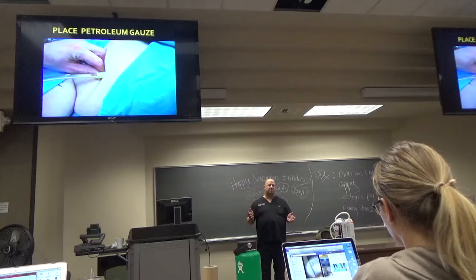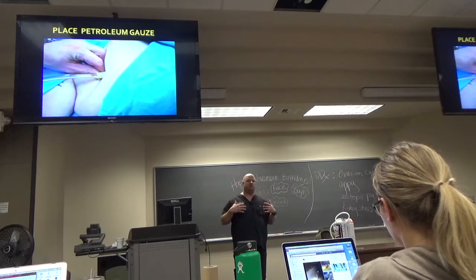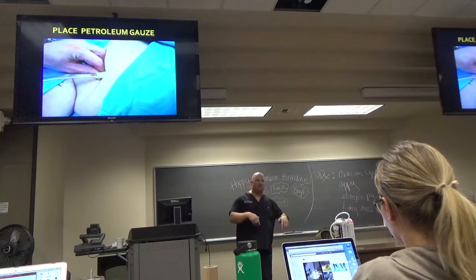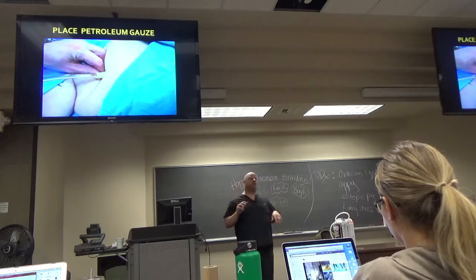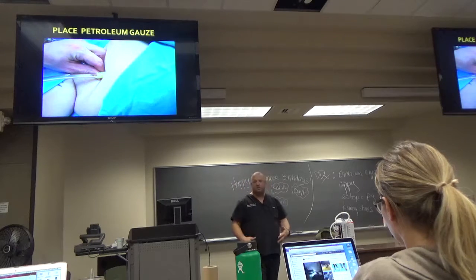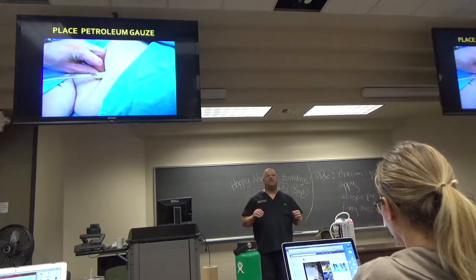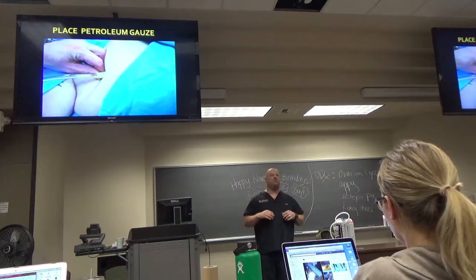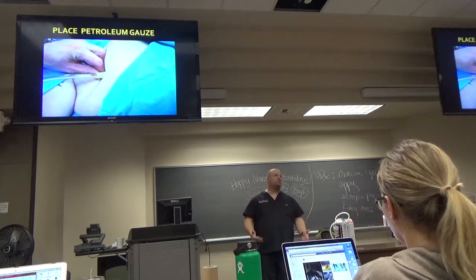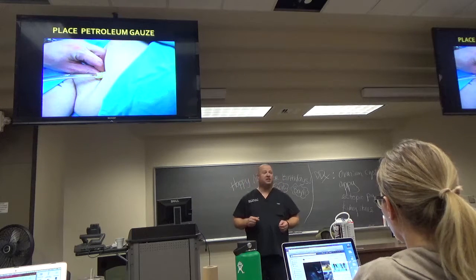There's this new mannequin. It's about $40,000, and it has the ability to have asymmetric expansion for tension pneumothorax. And we have blast injuries on one extremity, and blood shoots out on the arms, and you put on tourniquets, and if your tourniquet is on appropriately, the bleeding stops. So there are some really cool lifelike mannequins that are great for honing your skills and getting good practice. But there is no substitution for cadaveric specimens.